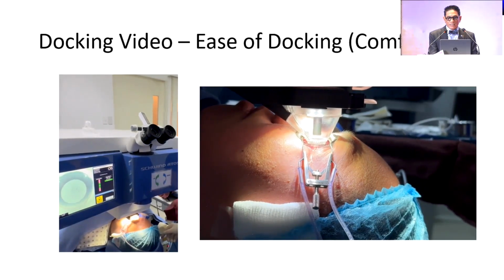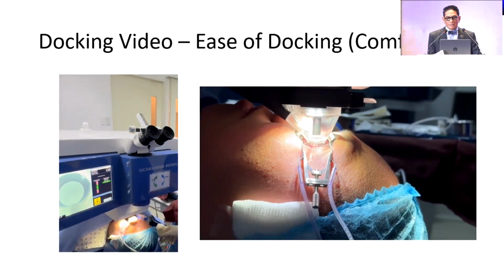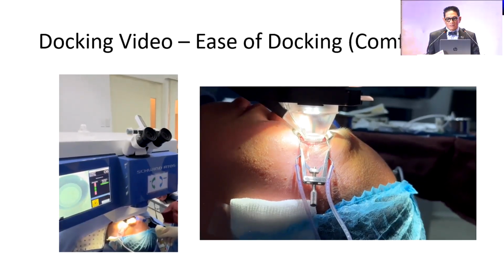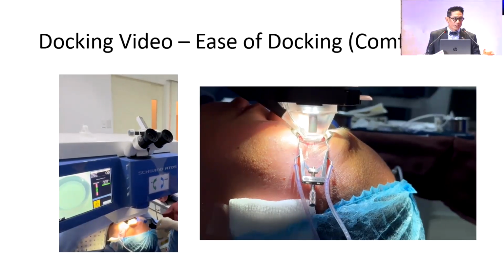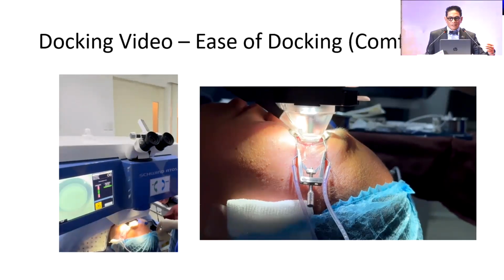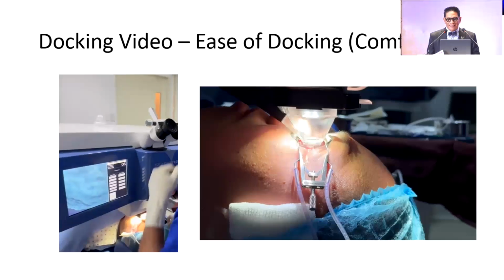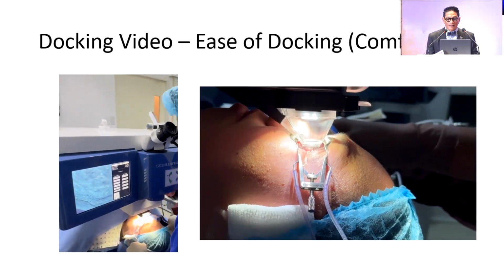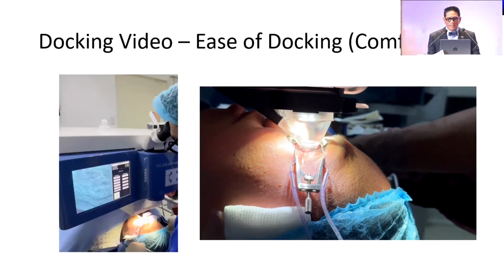And as you can see here, inside the patient interface, the laser is there, and you can see it will actually do some lasering. It's shaking. That's the posterior laser, and then after that, another shaking. If you can see in the patient interface, that's the anterior laser. And then after that, the incision, and then we undock.